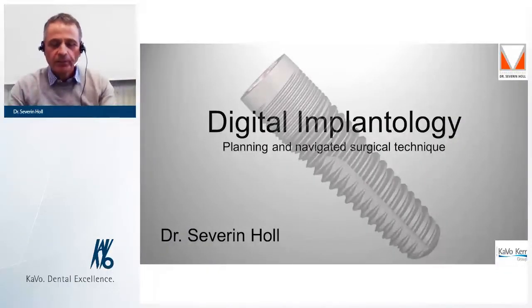Okay, let's start my presentation by showing you how we integrated the new digital technologies in the field of implantology in our dental practice. You will see different implant systems which we have tested in combination with the navigated surgery. For us, the legacy and interactive system is best suited for the combination with the digital workflow of the navigated surgery. So we use only these systems in our practice since last year.